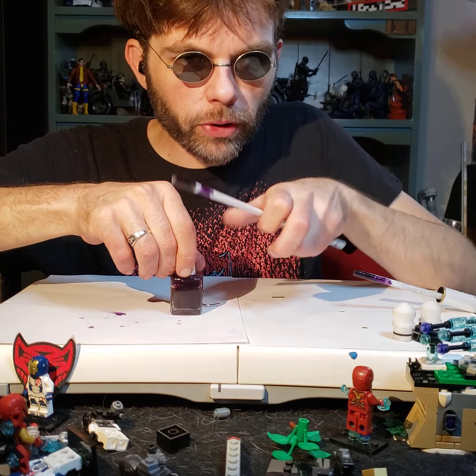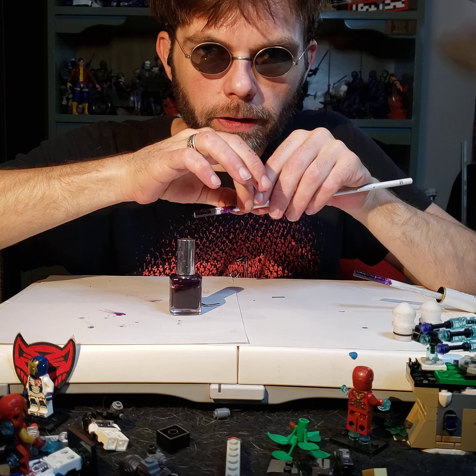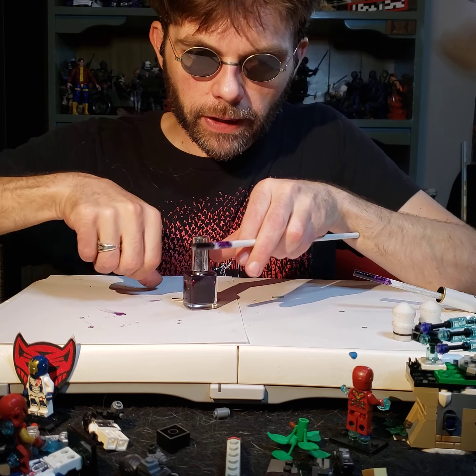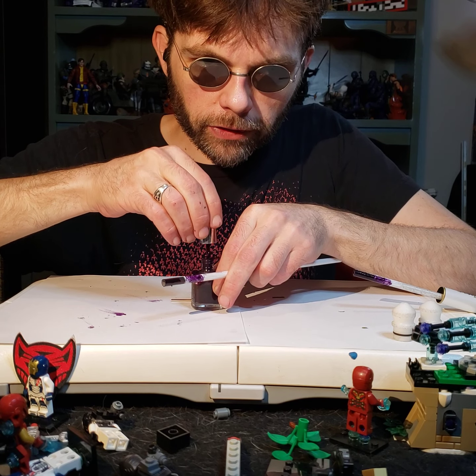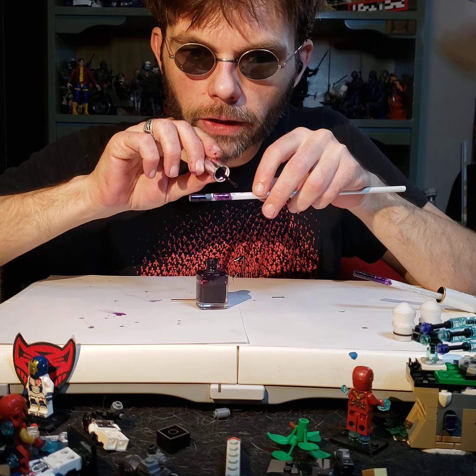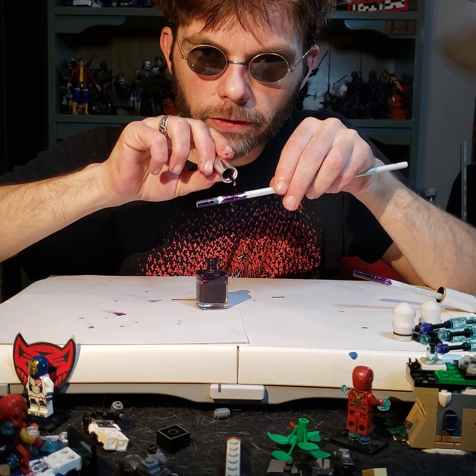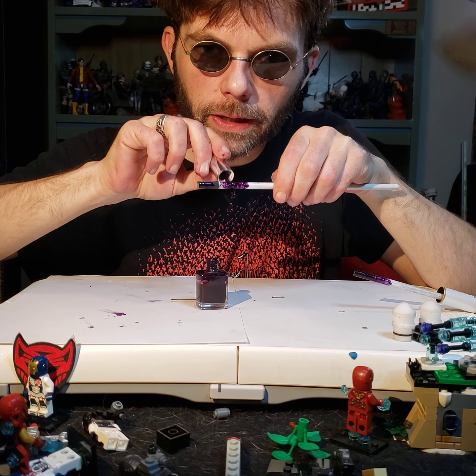I think I got a nice little spread on this one. And hopefully, but just in case, I did kind of put it on the very end of this one. We're gonna thicken that line up just a bit and prepare for erosion. This is me preparing for the fact that as it gets used, this nail polish will get taken away over time with constant use, because trust me, if you're doing your cane right, you are constantly using this thing. This is a constant use item. That is why this carbon fiber has gone smooth where it used to be a rough texture, because of the constant use. And putting this paint down is how you fix it.